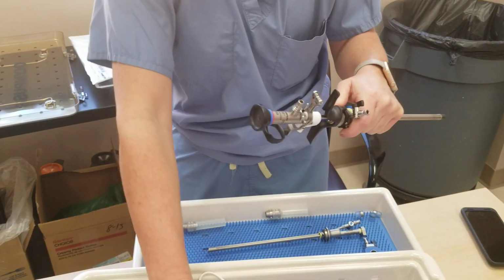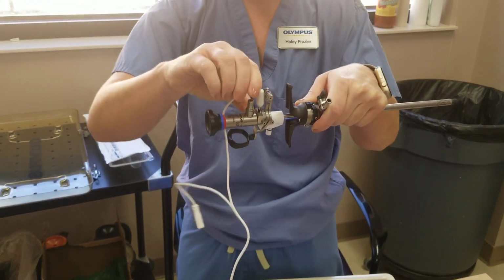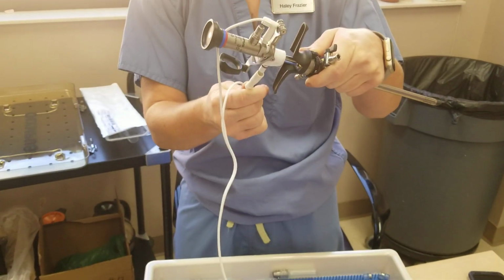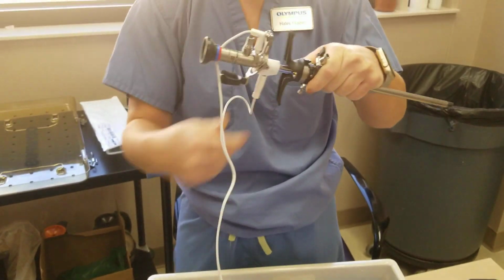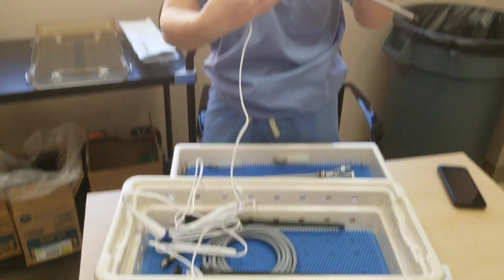And then to connect your disposable cord, it connects in two places. One here and one here. And then this is thrown off and plugs up to your generator. Okay? So this is the whole resectoscope.